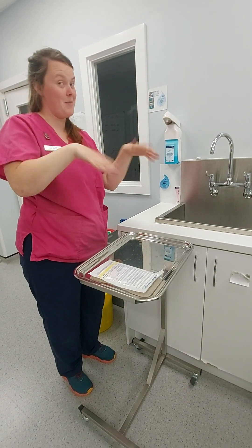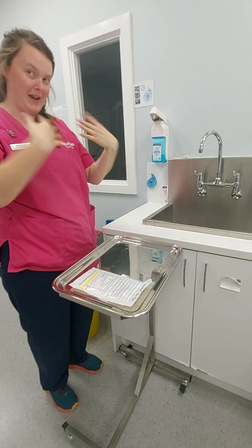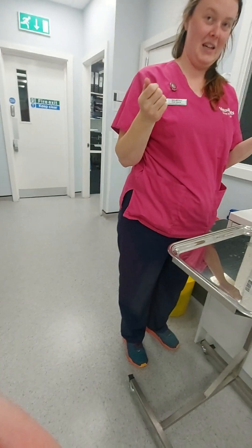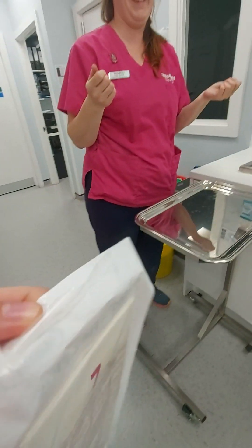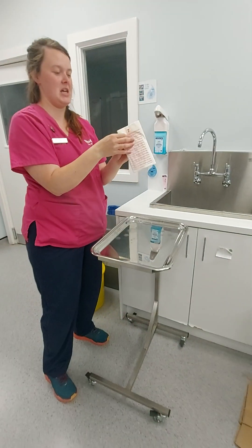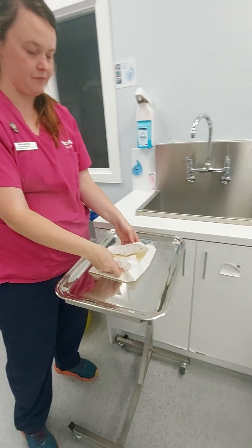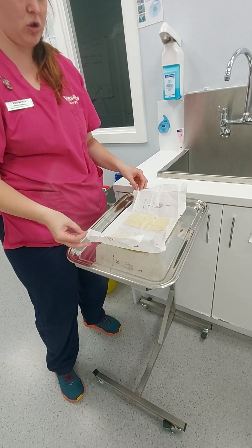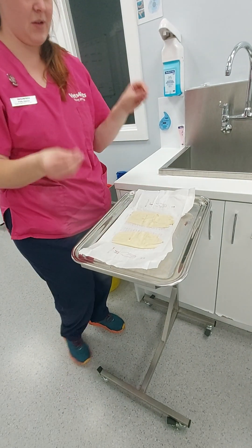Now, I'm not sure how Emily's going to do this whilst filming, but Emily, could I ask you to open my gloves in a sterile manner, just like I taught you to do — opening the packet like peeling it out. Emily's now opened the gloves for me, so we take them out, open them up, and pop them on a sterile surface. Try as best you can to not touch the packaging too much, keeping your fingers to the corners. Give yourself a fighting chance.